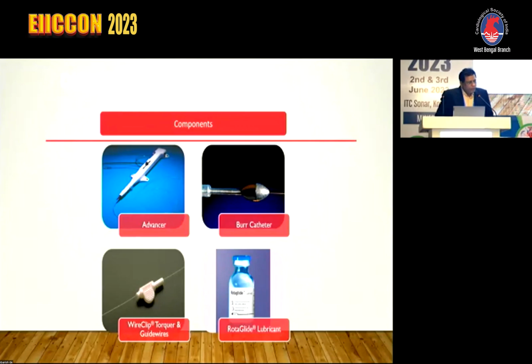Although very seasoned operators like Dr. Samin Sharma have shown it many times, the company discourages doing these things. So Dynaglide mode is always to withdraw the wire, or to exchange the wire.